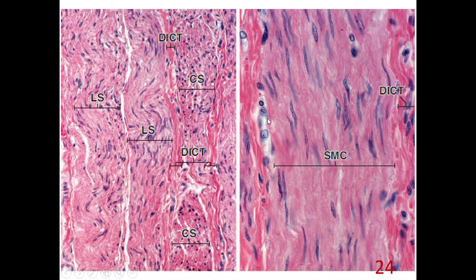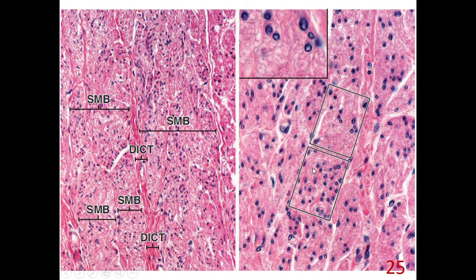And in another view, fusiform shaped fibers with centrally located nuclei, and this is longitudinal and this is transverse section here. When we look at transverse sections, nuclei are again clearly located centrally.